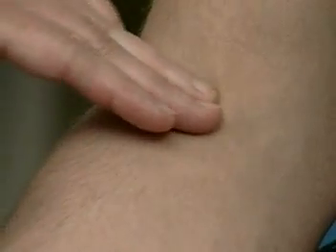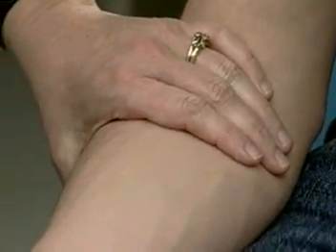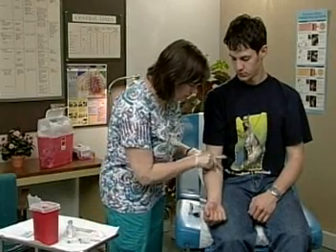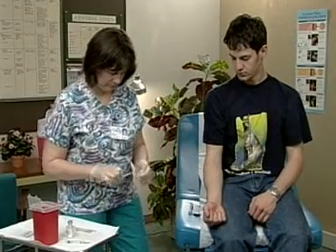Locate the landmarks 3 to 4 finger widths below the antecubital space, 1 hand width above the wrist. Choose the site. Clean the site with alcohol using a circular motion moving outward. Allow the alcohol to dry.